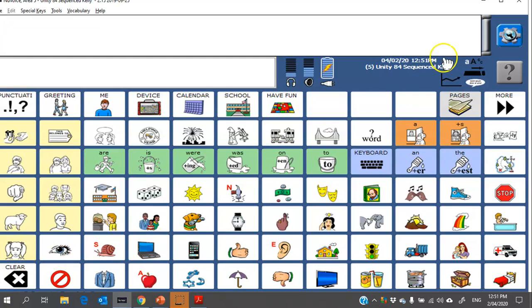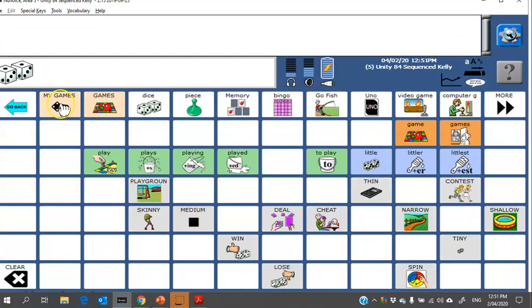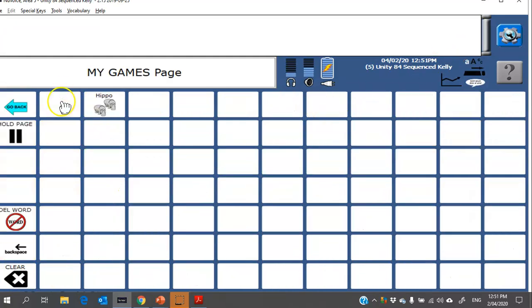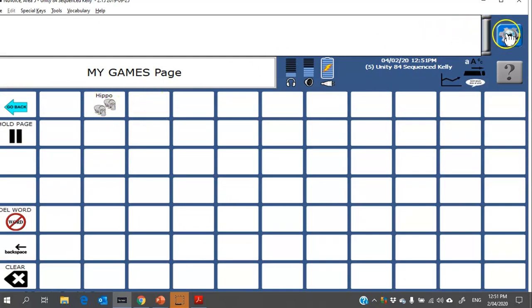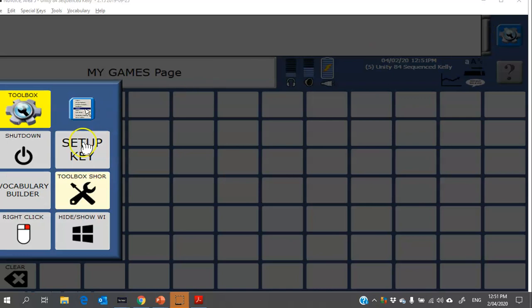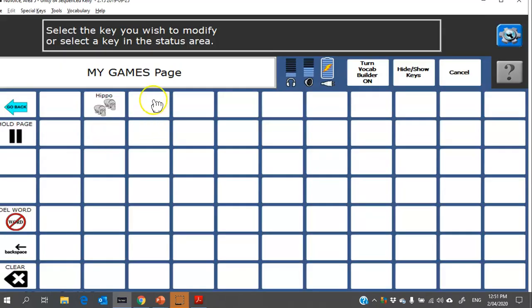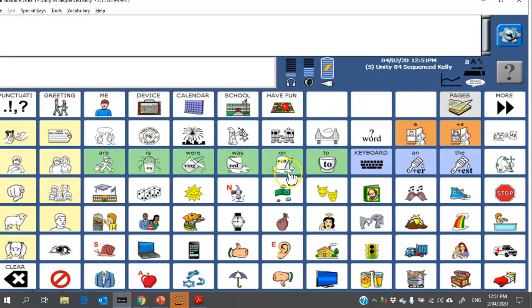So that's some simple programming for you. The most important thing before you go to the setup key is make sure you're on the page where you want to add. So go to the page first, make sure you can see that button that you want to edit or that you want to add, and then go up to your setup key and choose. All right.